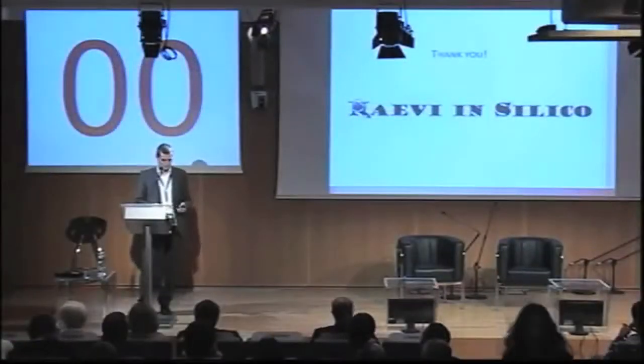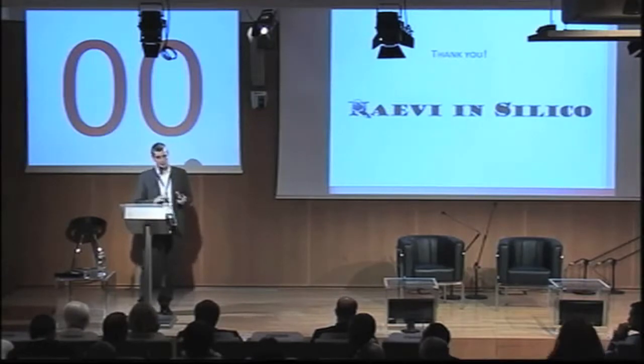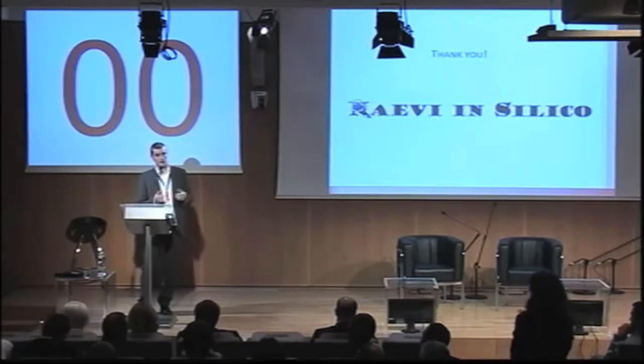Yeah, I will answer the second. We just need a smartphone like BlackBerry. We only have now the Android application, but we are translating to iOS, BlackBerry, and Windows. So we just need a phone that is able to shoot pictures. All the algorithms are via website, so there's no bound on the performance of the device.